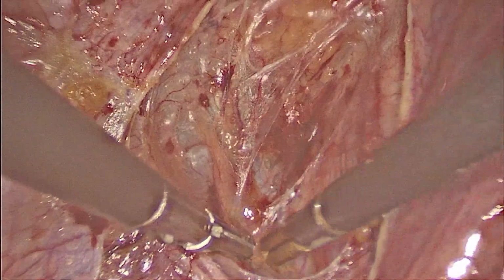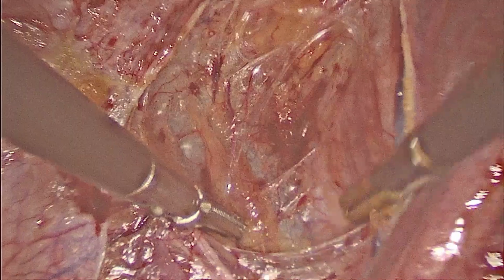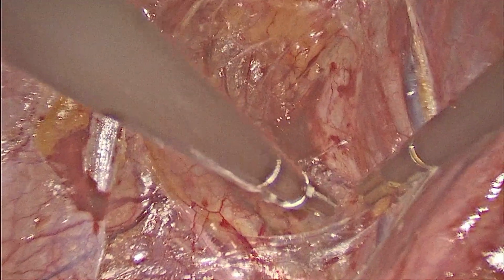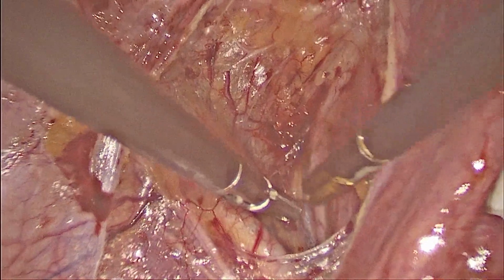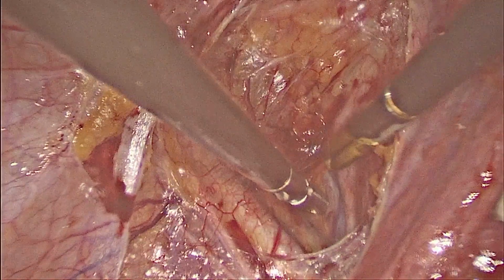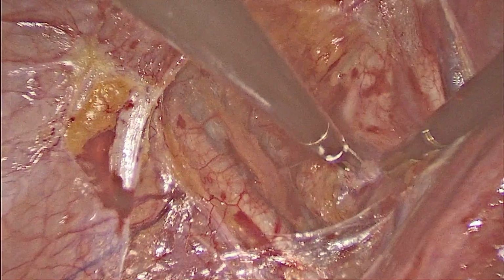That is, in the medial fold we are able to identify the ureter. It is always better to confirm it by its peristalsis and the longitudinally running blood vessels on the surface of the adventitia of the ureter.